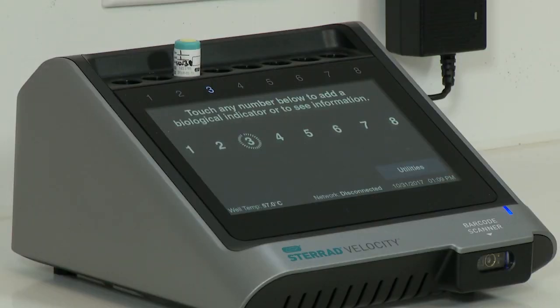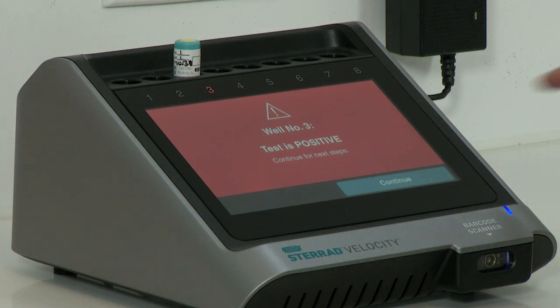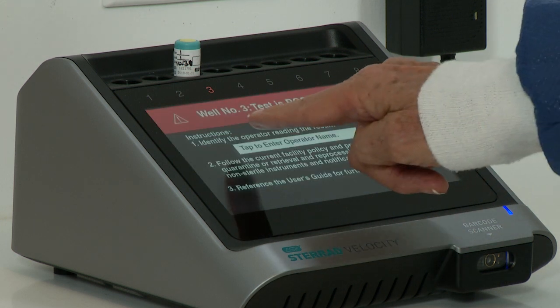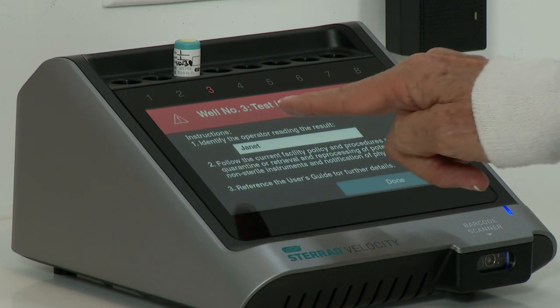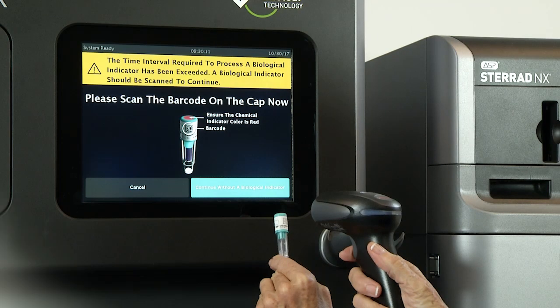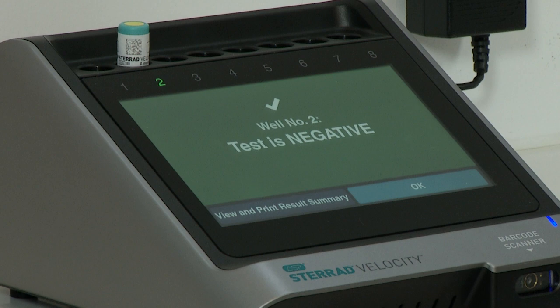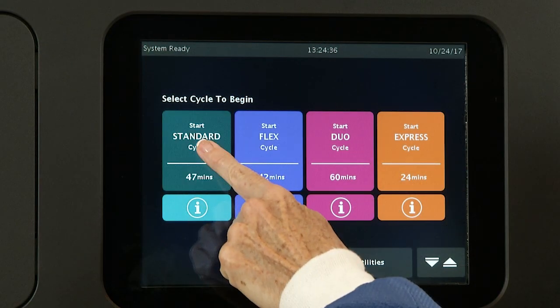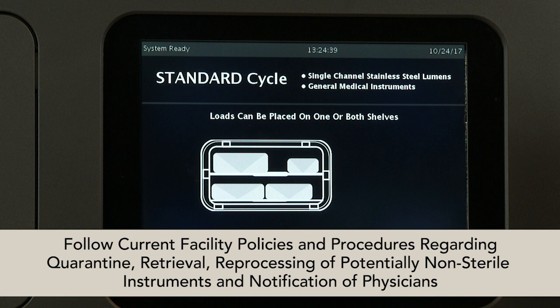A positive result on a test BI is indicated by a red well number. This result signifies that a sterilization condition was not achieved. If a positive result is observed, touch Continue or remove the BI to silence the alarm. Enter the name of the operator acknowledging the result and touch Done when finished. Then repeat the test with a second BI. If the second BI is negative, run a third BI to confirm sterilizer performance. If either the first, second, or third BI is positive, follow the current hospital or healthcare facility's policies and procedures regarding quarantine or retrieval and reprocessing of potentially non-sterile instruments and notification of the physician or physicians.